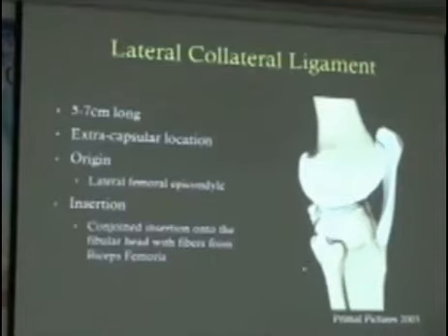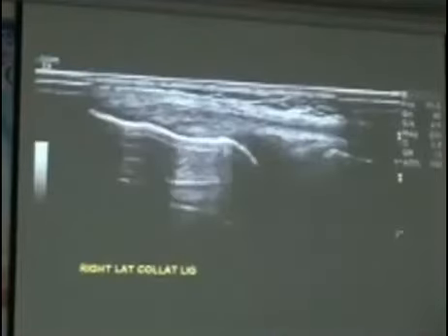So when we're looking at this area, sometimes that can look quite thickened, but it's just because there's two fibers coming in at slightly different angles as well. So this is the proximal aspect of the lateral collateral ligament. Once again, it's got a fairly broad footprint and then comes down sitting over the top of the meniscus.